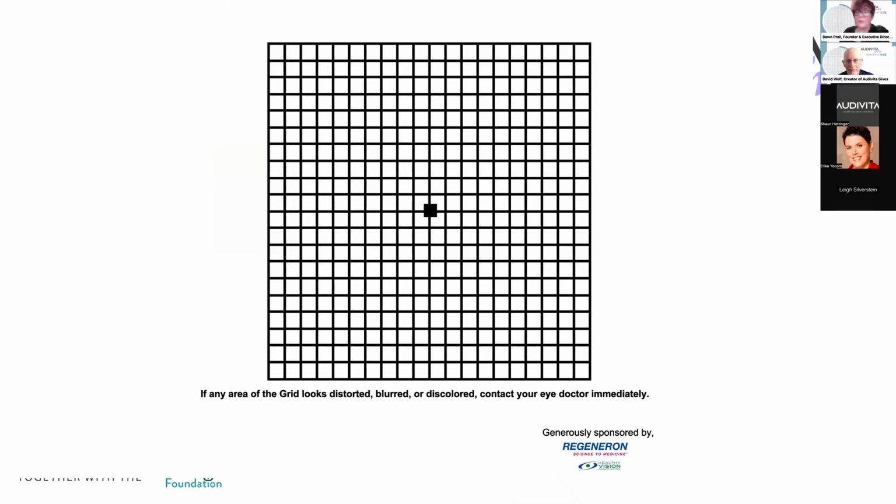So this is the Amsler grid. For those of you, depending on where you're at in living your life with your macular degeneration, you may or may not be able to see this, or you're going to see it differently. Remember, the one important thing as I start to go through the steps in using the Amsler grid is that everyone is different, with their low vision struggle, their status, if you were recently diagnosed with macular degeneration.